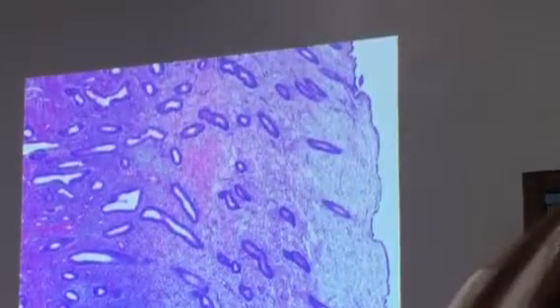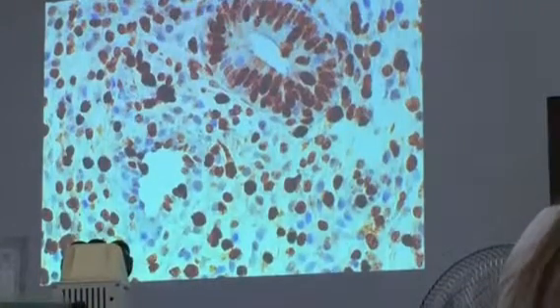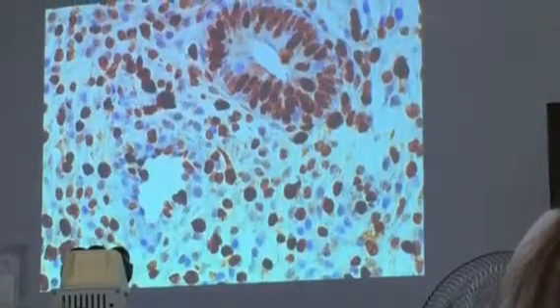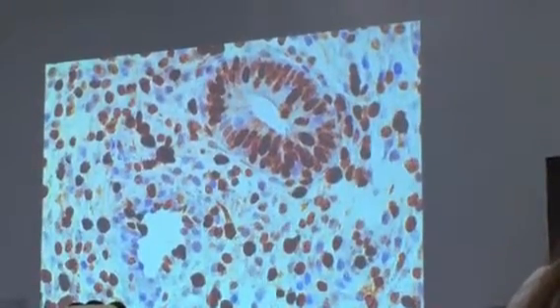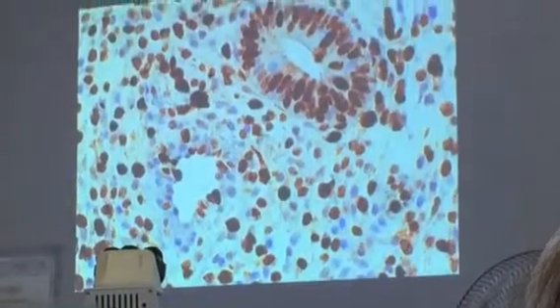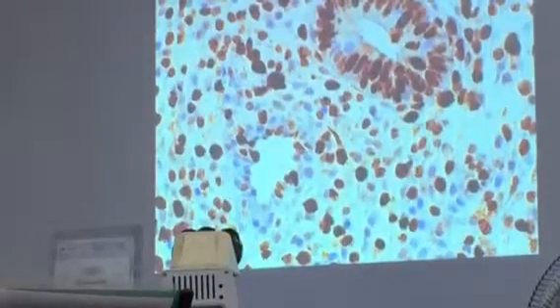That's because the stromal cells do not have too much cytoplasm. So the nuclei are closer together, which is why it looks dark. Now this is a higher view of the glands. Because they're proliferating, they are actively proliferating. The nuclei are compressed together, which is why this is called pseudostratification. They look like they're stratified, meaning more than one layer of cells. But in actuality, they're just very close together, trying to fit into each other like a jigsaw puzzle. So one may be higher than the other.